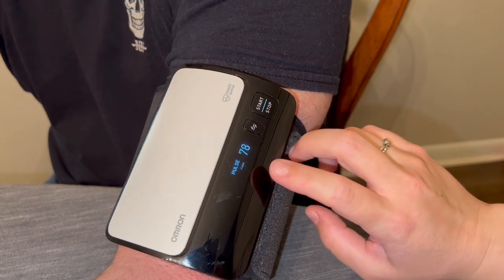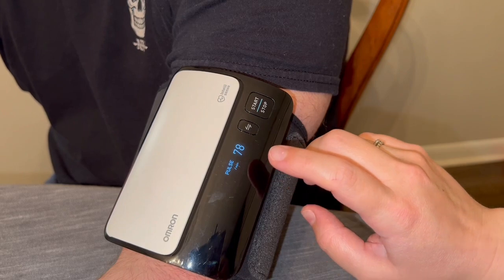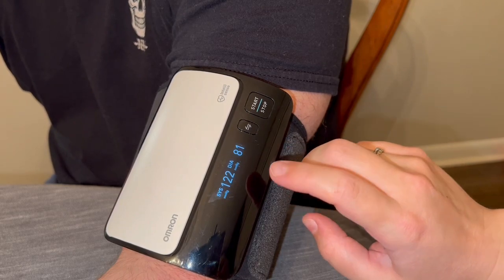So it just stopped there. It shows the pulse as well as the systolic and the diastolic readings, as well as the heart rate pulse.